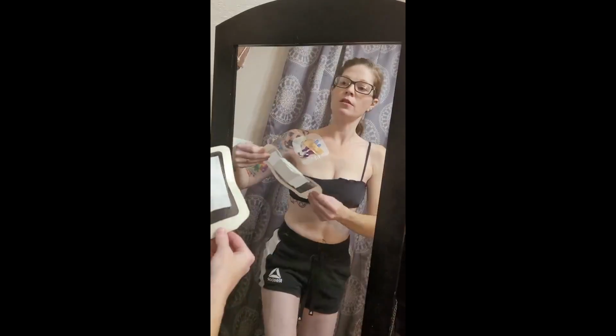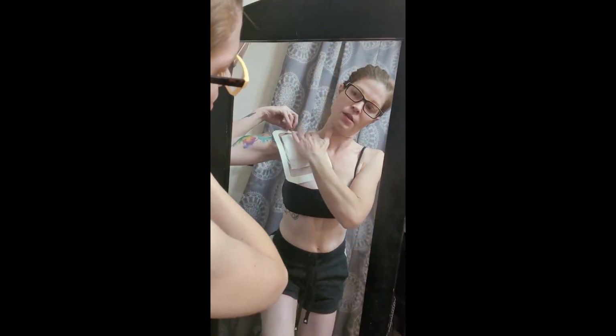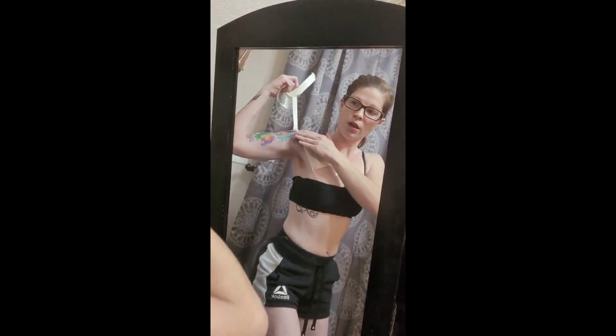I'm going to show you how, now that my skin prep is dry, how I cover. Okay, so now I'm going to look in my mirror and line up my 2 square bandage piece over my dressing and around the outside. Press, you can kind of tug a little bit to make sure it's tight and covers. And once you get it pressed, you're going to want to carefully lift up this last little piece of paper and carefully peel it off the edges, kind of going around behind and pressing too, because if that lifts up, it will make your edge not quite as secure. And then there you go, all ready.